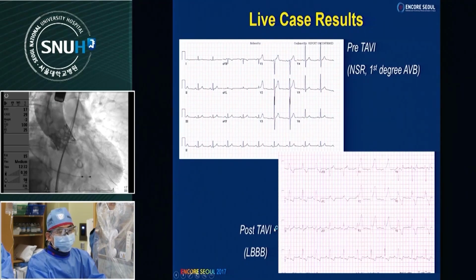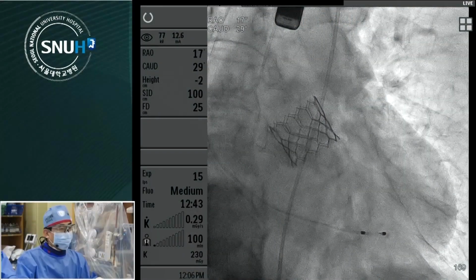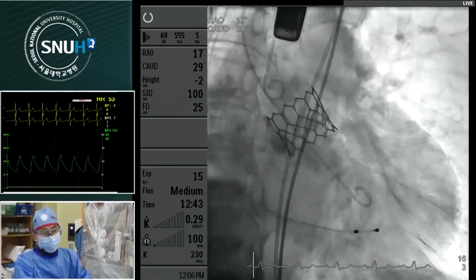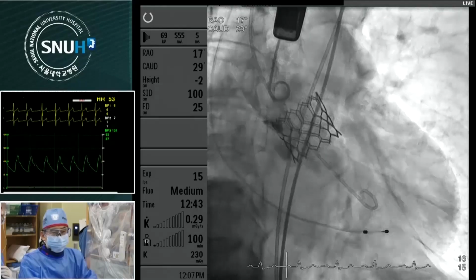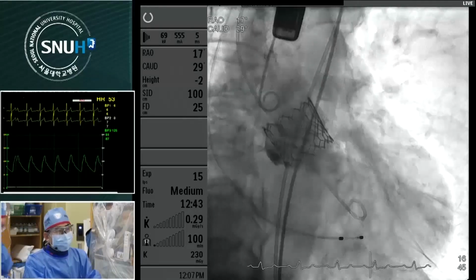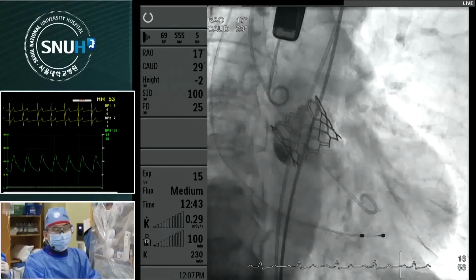I think so. Thus, from now on, I'd like to remove the ventricular pigtail and reassess the regurgitation with angiogram. Temporary pacemaker, in case of LBBB in SAPIEN situation, I keep the temporary pacemaker overnight. Then next noon, I decide to remove it or not. In this case, I expect there is no further aggravation. Usually, in the worst case of SAPIEN, the conduction delay worsens for about 3 or 4 days. But I guess we can remove the temporary pacemaker tomorrow noon.